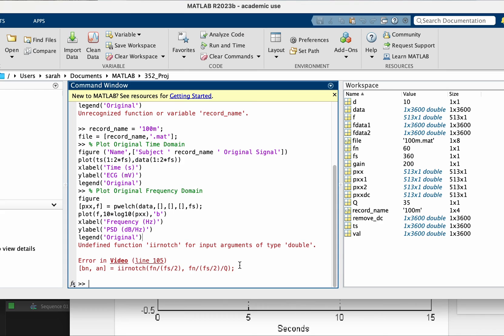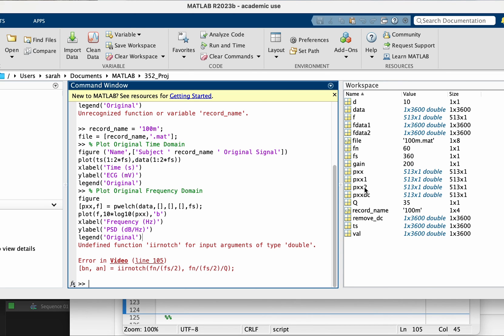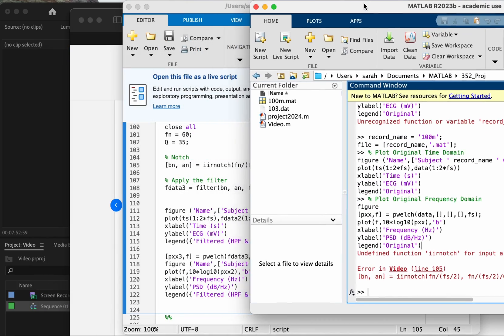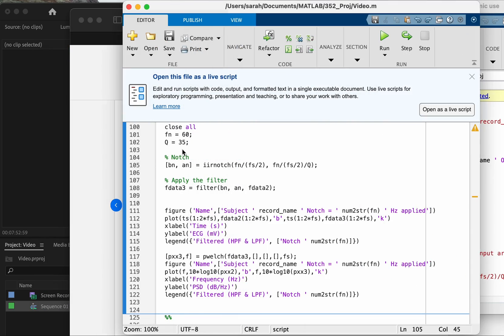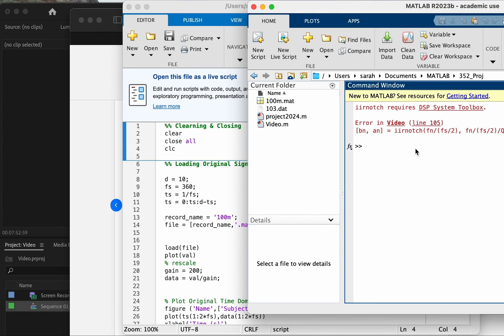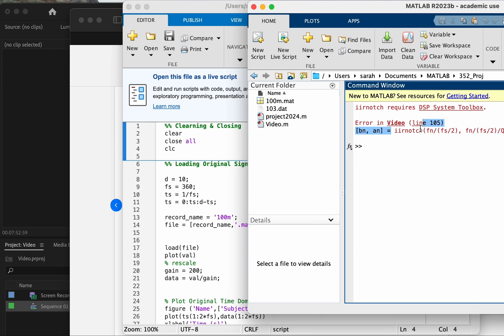In here it didn't tell me that I'm missing the DSP toolbox, which is the digital signal processing toolbox, but from experience I know that this is the issue. For you to know, there's a trick to have MATLAB tell you this explicitly. You need to clear and clean everything and then run it again.